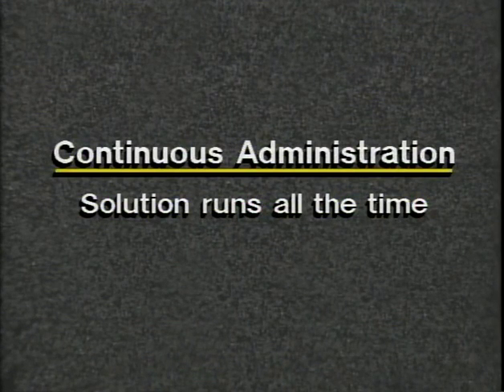The patient on continuous infusion must receive care while the IV line is attached to the pump. You must know how to modify care delivery to protect the line and assure uninterrupted flow. Discuss with your supervisor any need for special clothing with snaps along the arm. It is very difficult to fit a shirt or pajama top over the pump on a pole.